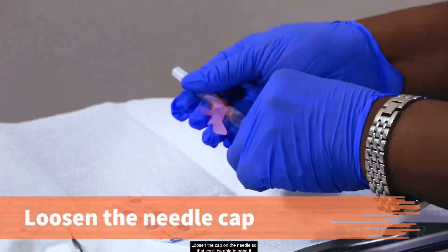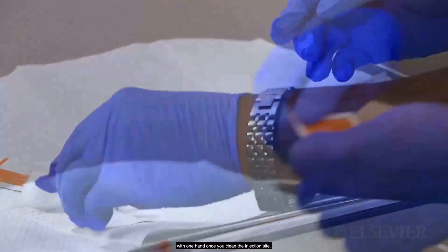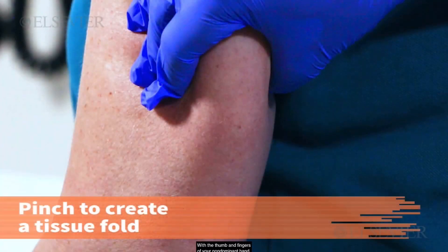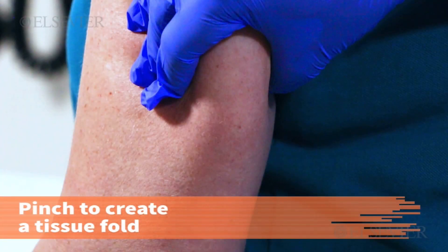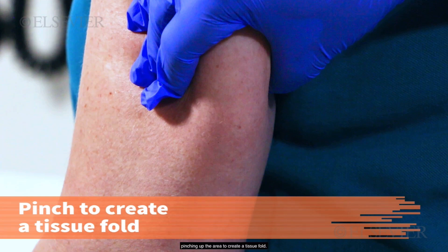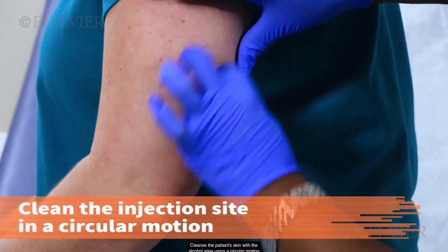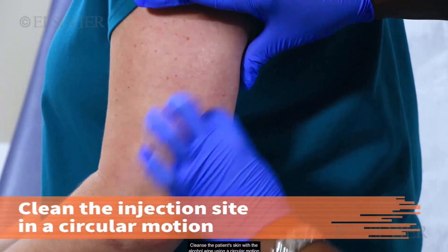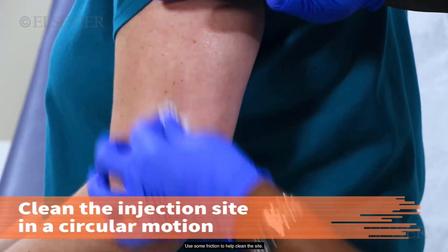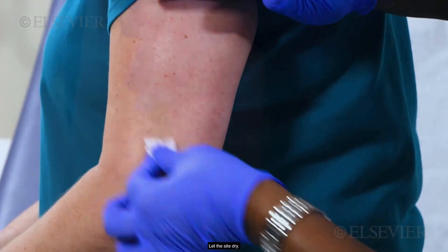Loosen the cap on the needle so that you'll be able to open it with one hand once you clean the injection site. Open the alcohol wipe. Cleanse the patient's skin with the alcohol wipe using a circular motion and moving outward from the center. Use some friction to help clean the site and create about a 2-inch circle at the site. Let the site dry.